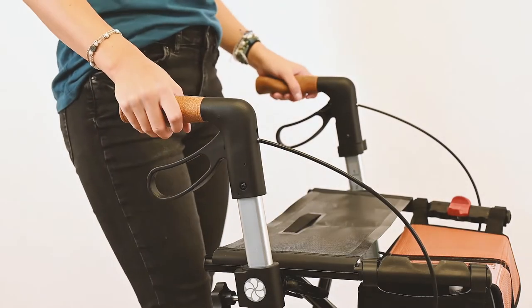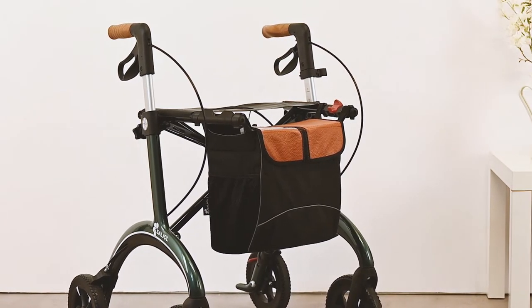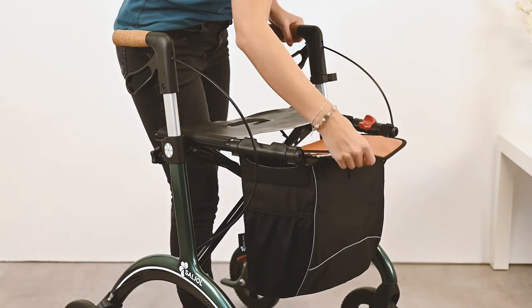The cork handles provide a comfortable grip and protect against slipping. A stylish bag completes the design, with a magnetic closure for easy opening and closing.